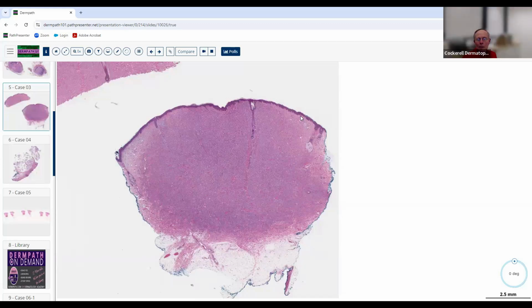It's certainly not typical squamous epithelium. It's not follicular. It's not sebaceous. Maybe if we go to higher magnification, we can see some apocrine decapitation secretion in some of the cells. Who knows? But certainly it doesn't look like the traditional classic epithelial differentiation that we see, but it does look like the cells are pretty closely opposed to one another. And it doesn't look like a spindle cell lesion with that fibromucinous loose stroma like we saw in the very first case. Right. So if it's an epithelium, it's going to be a different type of epithelium.